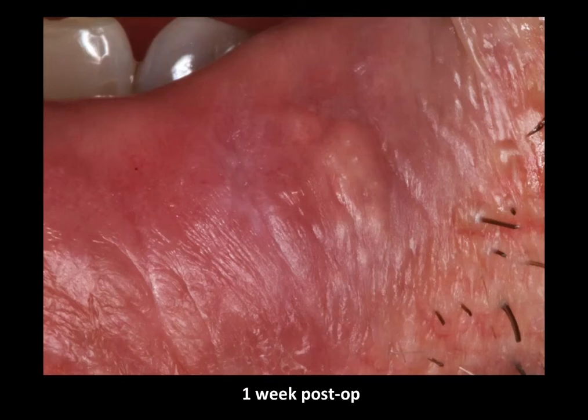1 week post-op, and our patient was just amazed because he did get a lot of aphthous ulcers and was just amazed at how fast and efficient it was and the immediate reduction in that burning sensation or pain that they experienced with an aphthous ulcer. And you know, these ulcers last 7 to 10 days normally.